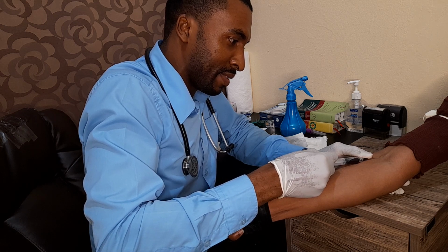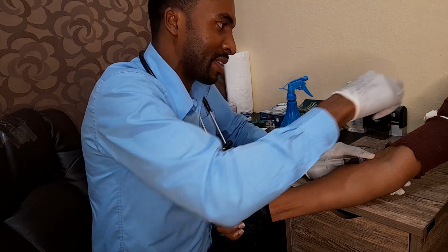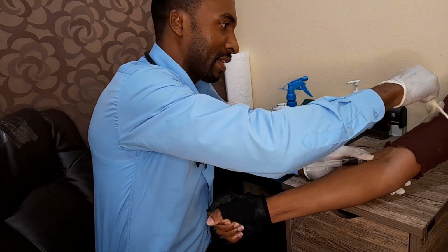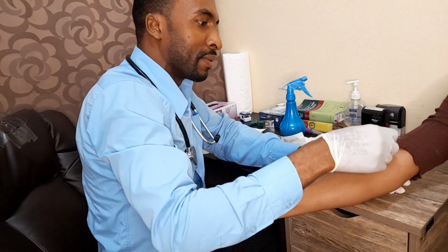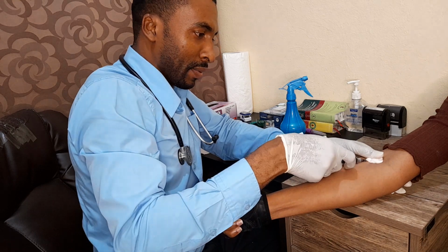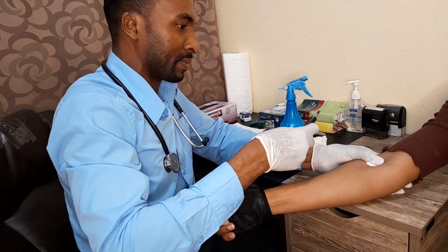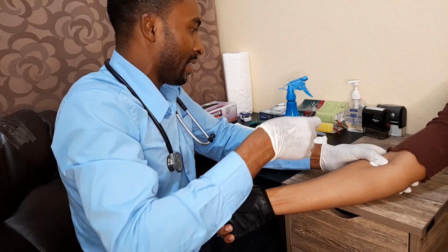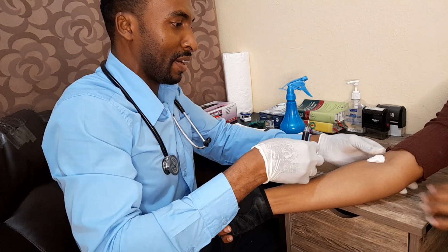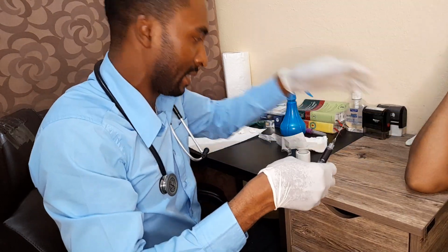And for a CBC sample, we normally need about 2 to 3 mL of blood max. So when we pull back the blood, we remove the tourniquet and remove the needle and the syringe and compress the vein, right? We can either ask the patient to compress the vein, or we could ask her just to bend her elbow for 5 minutes.